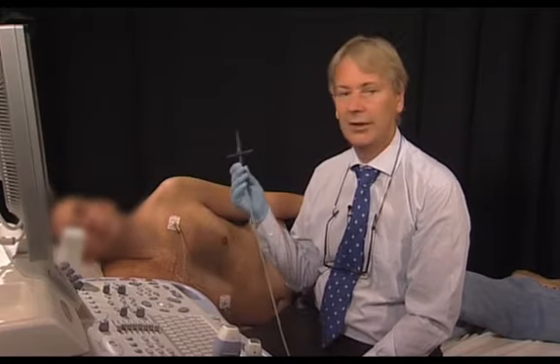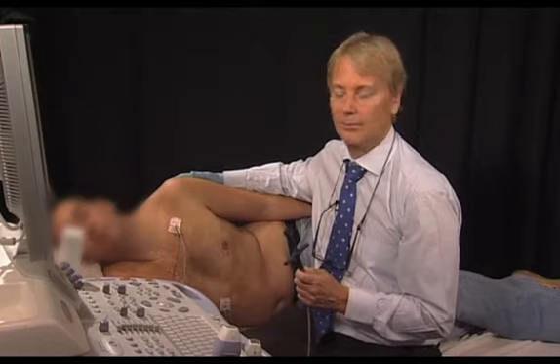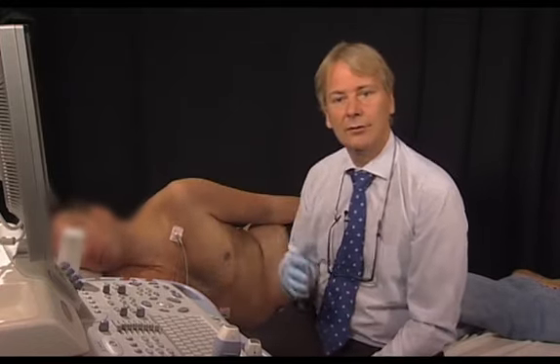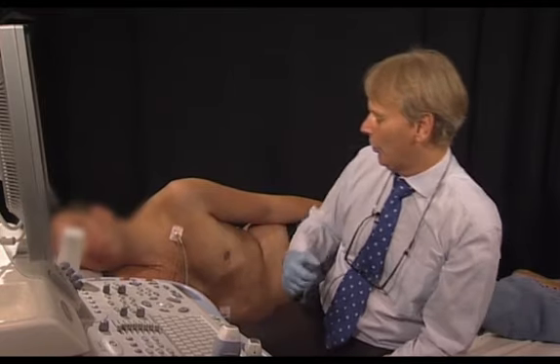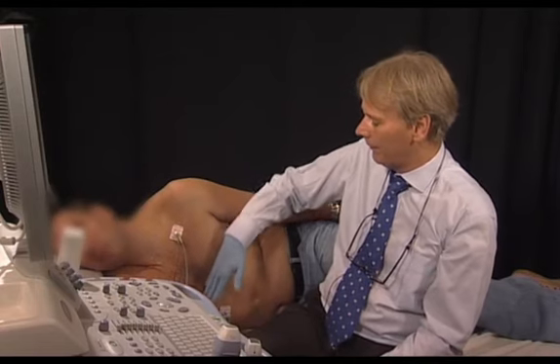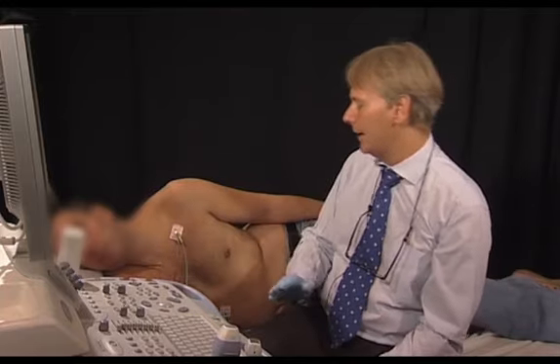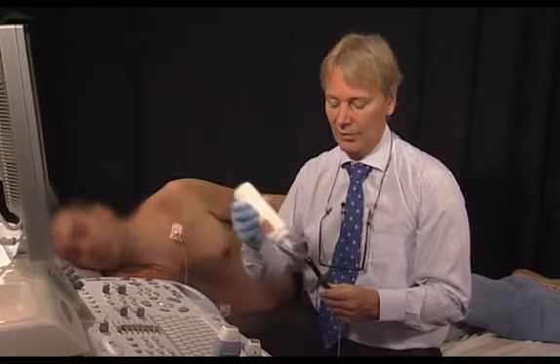To quantify aortic stenosis from a right parasternal approach, we also need the pencil probe. It is also important to position the patient in a position where he's turned as far as possible towards the right. And then we have to remember what the anatomy of the heart is and where we can actually expect the jet to be or to go. So the heart is here on the left side, and the jet can go in many directions. You can go fairly flat, but it can also go fairly steep towards the head. So we have to try more positions and more windows and try to see where we get the optimal signal and the maximal velocity.